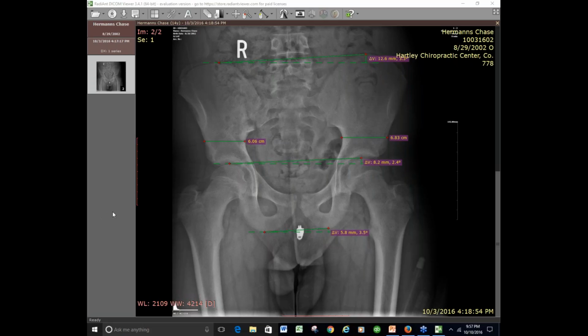All right, and it looks like Marion has one more question. Let me go ahead and unmute Marion. Yes, that was very interesting what Greg brought up too. My question is, I have a doctor I've been working with, and I was trying to teach him how to stand for the X-ray. He is so knock-kneed that if I place his feet in the proper position, his knees would overlap. And trying to get them so that one is not anterior to the other is next to impossible. So I'm not sure what to do in a case like that.